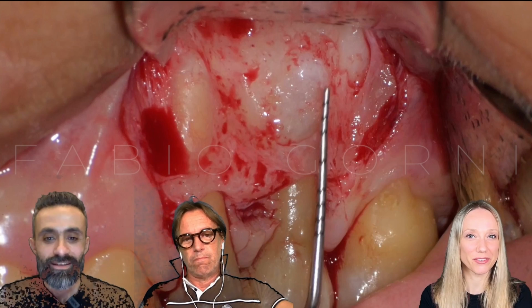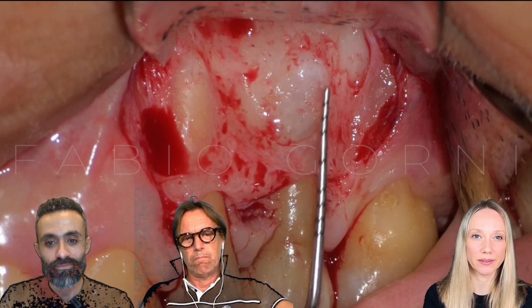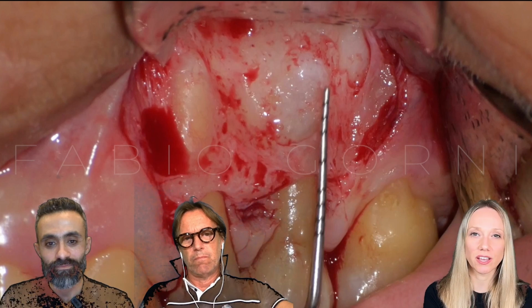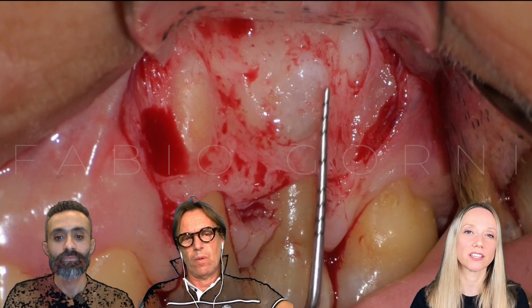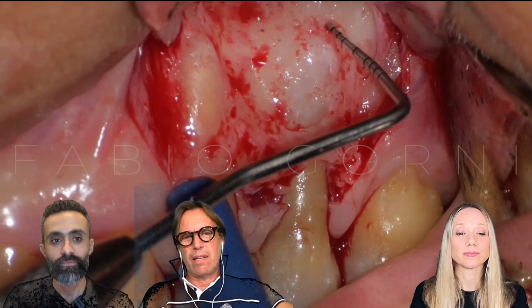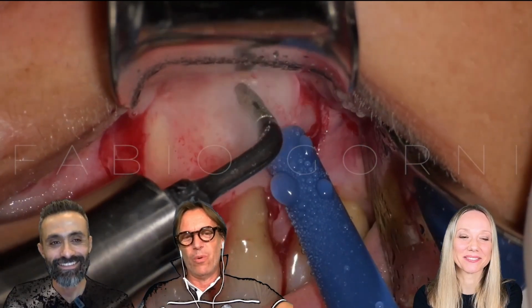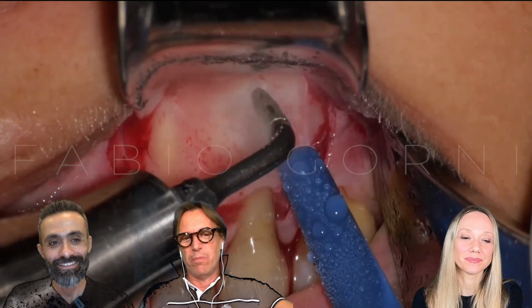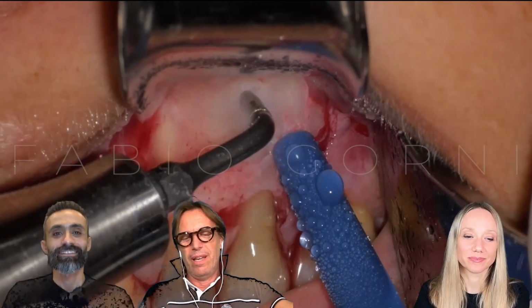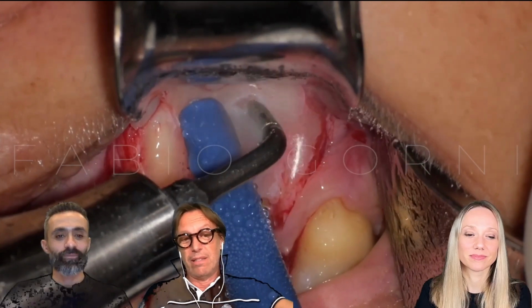Very, very informative. Thank you very much, Fabio. And now let's switch to the hard tissue management. When the cortical plate is intact, so there is no lesion, how do you decide where is the starting point for your osteotomy? It's exactly in the video that I'm showing. It's so simple. We have to make some measurement on the X-ray, and then we can use the probe and check the length of the root. And after that, it's done.